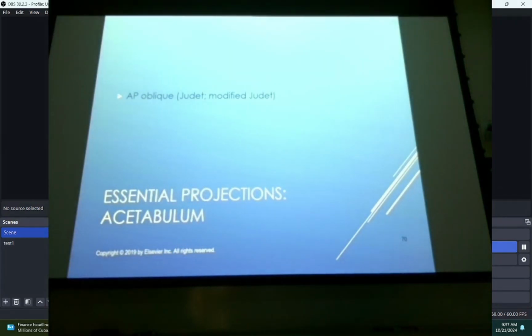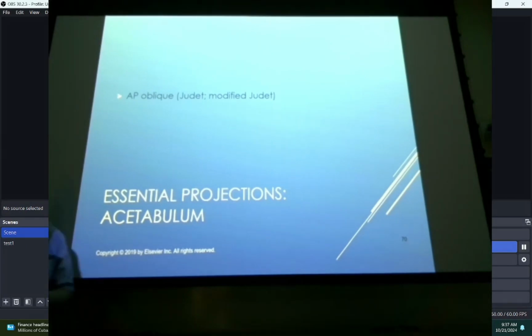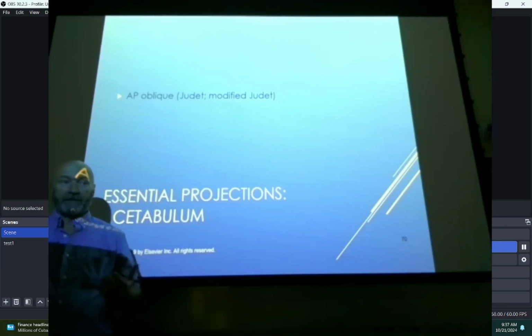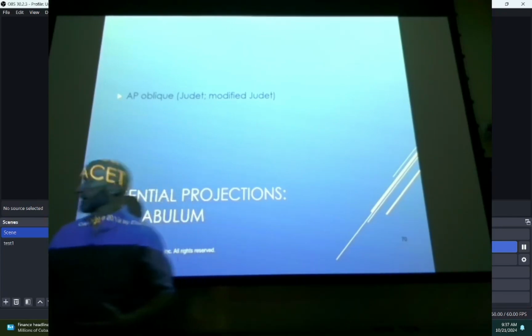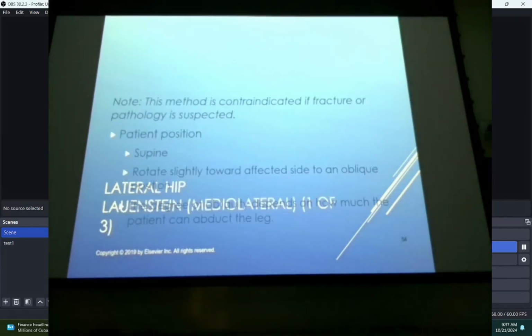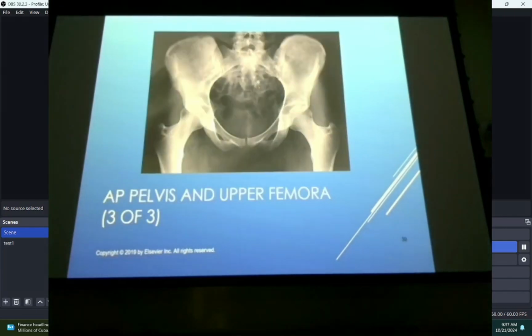So what if the patient's fractures are so unstable that you can't rotate the patient around? It happens. Pelvic fractures can be just nasty fractures. You got a lot of stuff going on there. Consider everything that you've got going on in the pelvis.